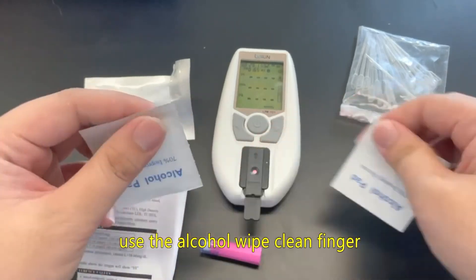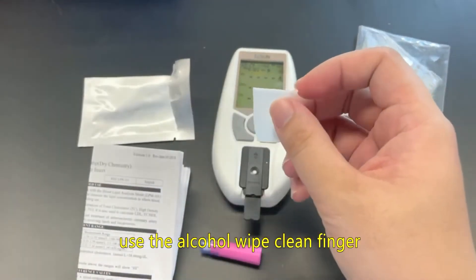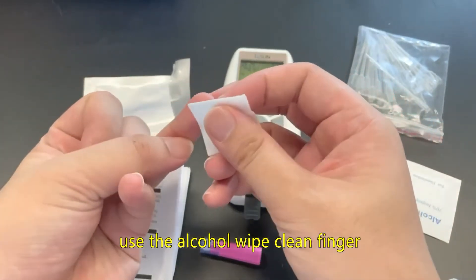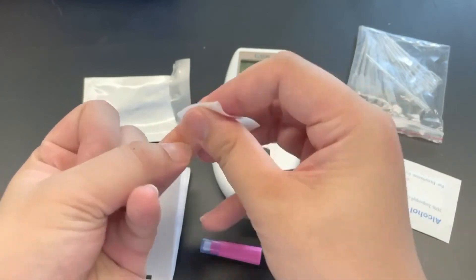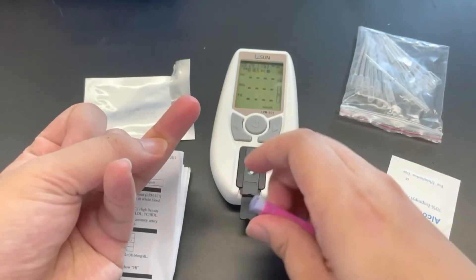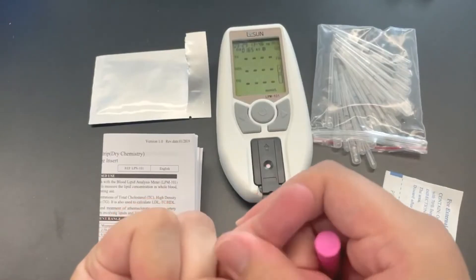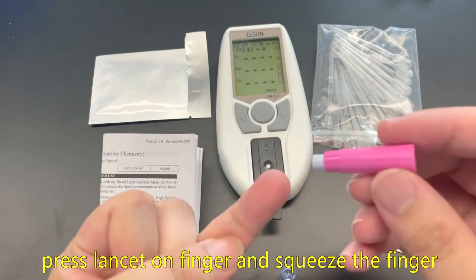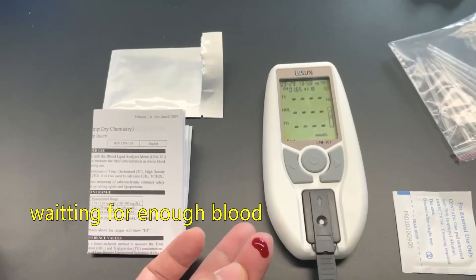Use the alcohol wipe to clean the finger. Wait for the finger to dry, then take a safety lancet and remove the protective cover. Press the lancet on the finger and squeeze the finger. Wait for enough blood.